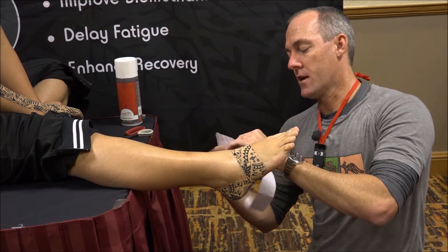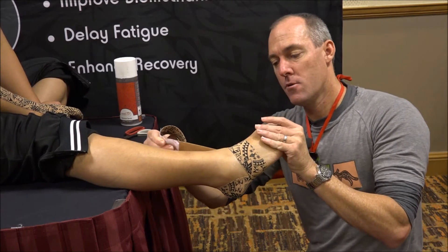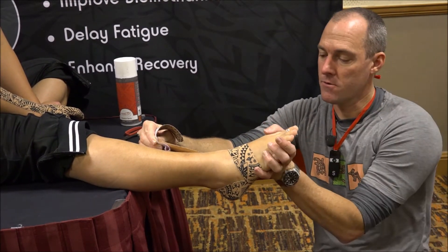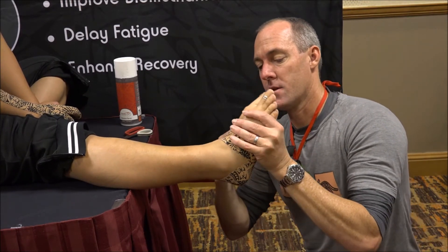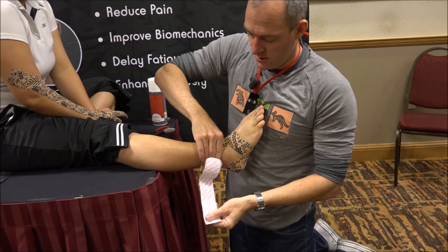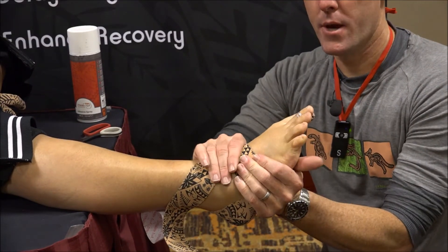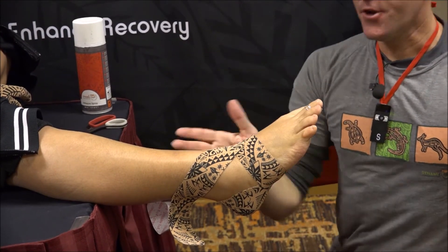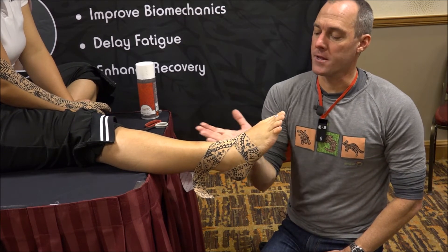At this end you can do a few other things. If you wanted to bring in a bit of direct tibialis posterior function, come up behind the medial malleolus in plantar flexion inversion — that's going to basically mimic tibialis posterior directly, resisting eversion and bringing the foot back. If you wanted more tibialis anterior, bring them into dorsiflexion inversion and run a bit anterior to the medial malleolus and lock off on that side — that gives more resistance to the arch dropping in that direction. Depending on what you want, if you can maintain the arch and decelerate the drop, that's going to reduce tibialis anterior and tibialis posterior overactivity anyway. But if you wanted to more directly bias one, you could do that.